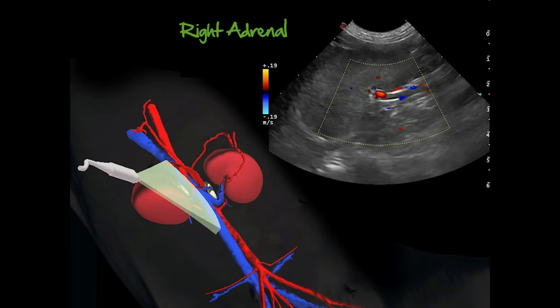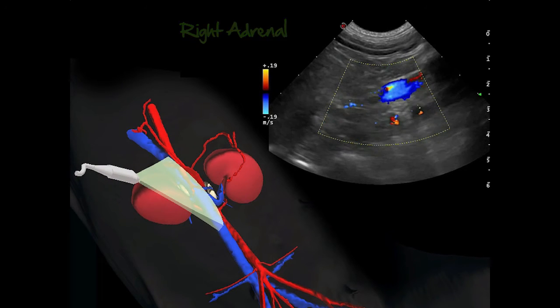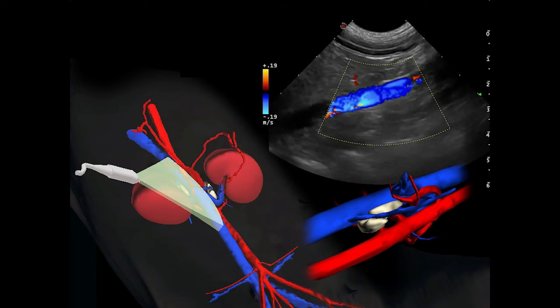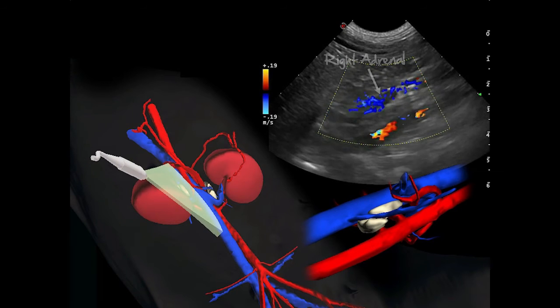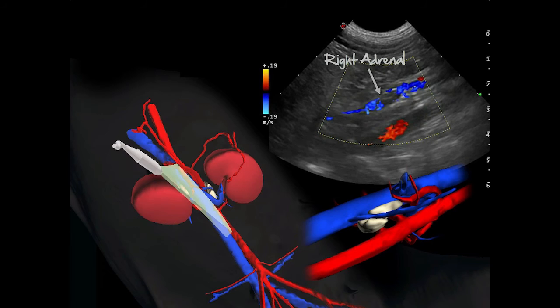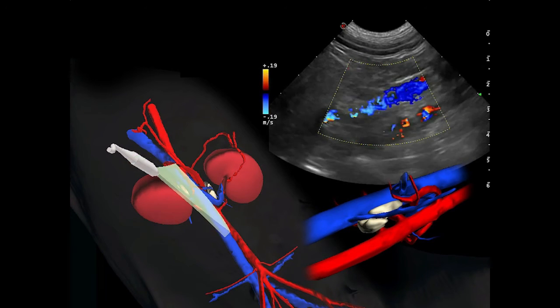In the longitudinal plane, and starting from the right kidney, move the probe cranially behind the costal arch, turning it gently into an oblique plane to locate the caudal vena cava and aorta. Using the same plane, turn the probe laterally to identify the adrenal just lateral to the caudal vena cava. The pressure applied by the probe may sometimes give the impression of a gland penetrating the lumen of the vena cava. You may sometimes need to move slightly laterally or medially to locate the gland.